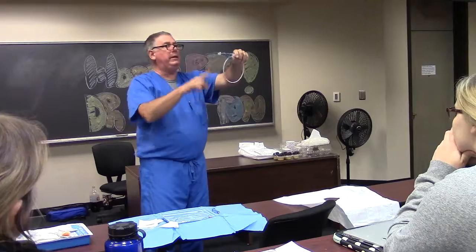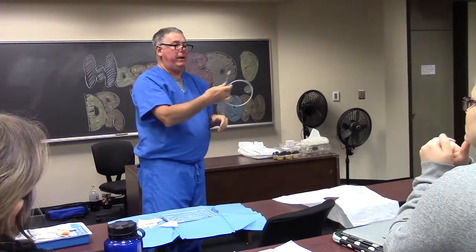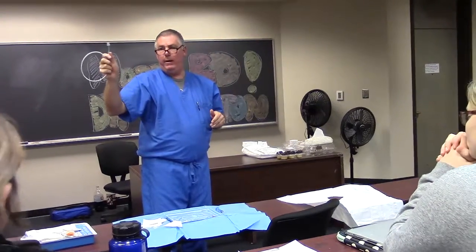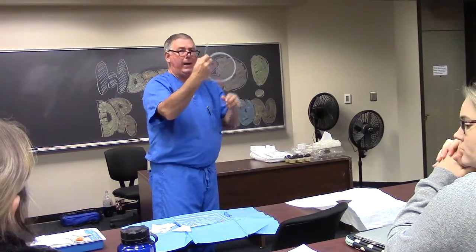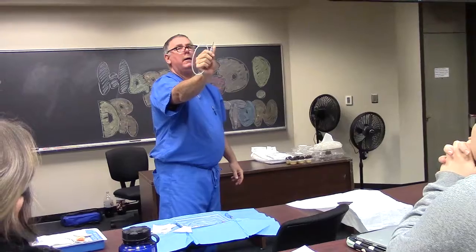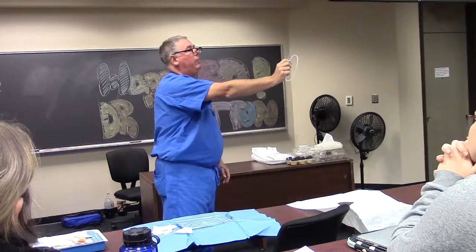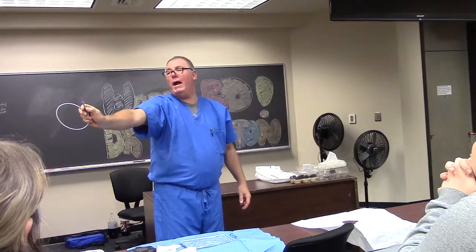So the different elements here, we've got the introducer needle. This is our J-wire. It comes prepackaged in this gizmo here. You can see the wire itself is right there. The way you operate this, you put your finger on that little thing right there and use your thumb to move the J-wire in and out. I'm going to pull it back and pull the cap off. So now you see the wire coming out? It comes out as a J. So I think this is maybe what you were talking about earlier. Yeah. So it just preforms itself into a J. You retract it all the way back, and now you're ready to go.